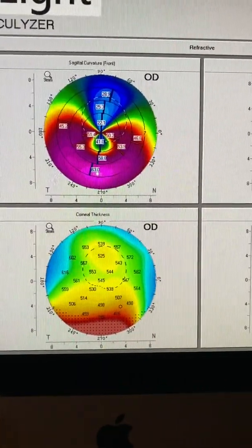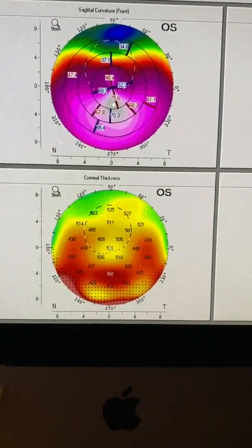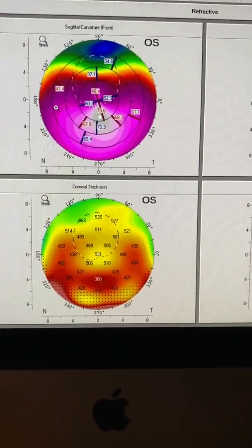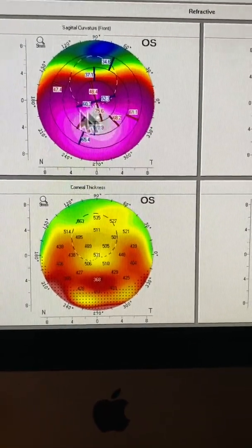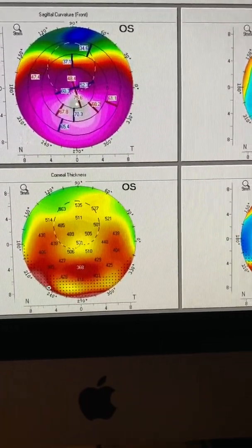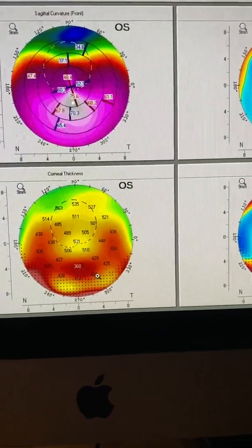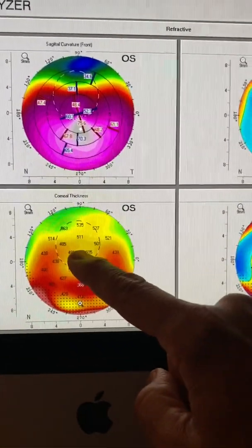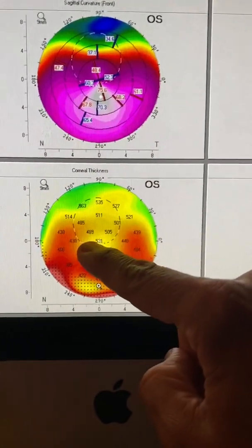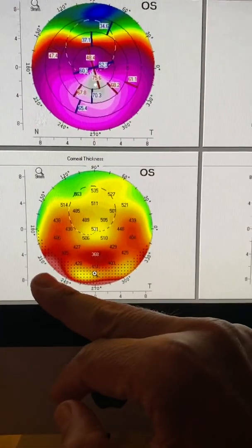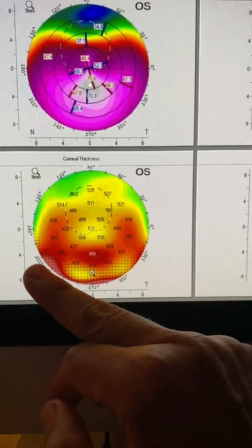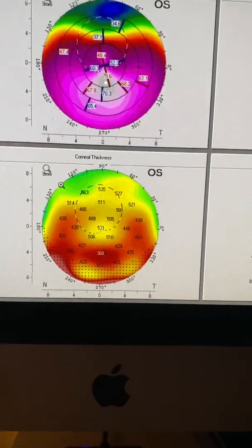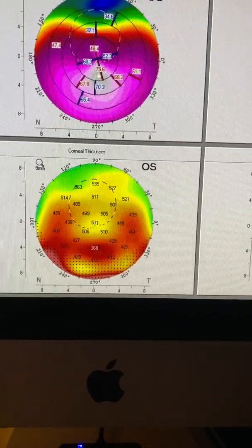So we're going to look at more images with the very advanced imaging that we have available today. This is the left eye. The claw-like is kind of lost here because the astigmatism is very high. But again, we can see that the extreme cornea periphery, remember the Pentacam only catches nine millimeters, and here the patient is looking upwards. The pupillary reticle is displaced superiorly. So we're looking around 10 millimeter diameter here. See how thin the cornea is at this area.